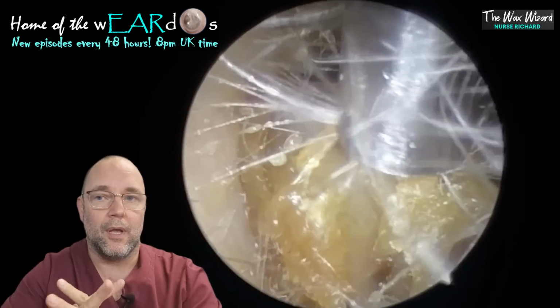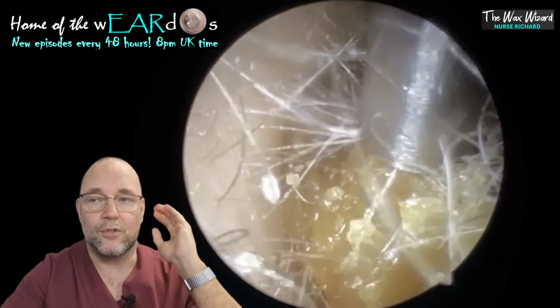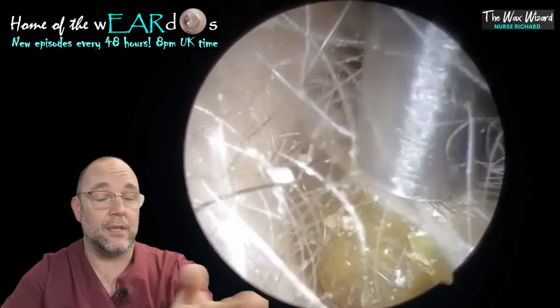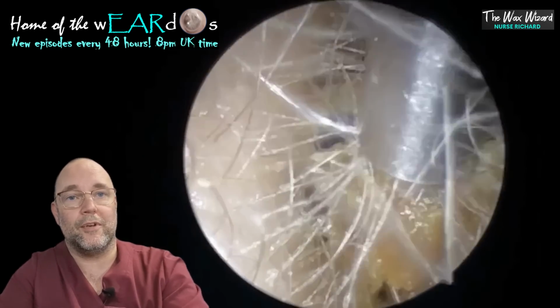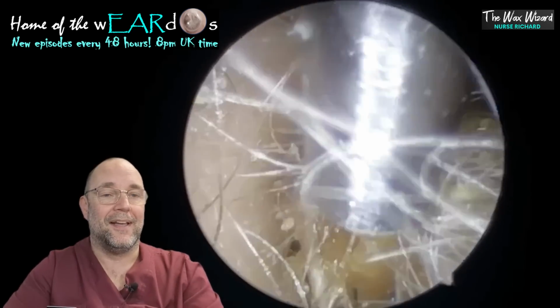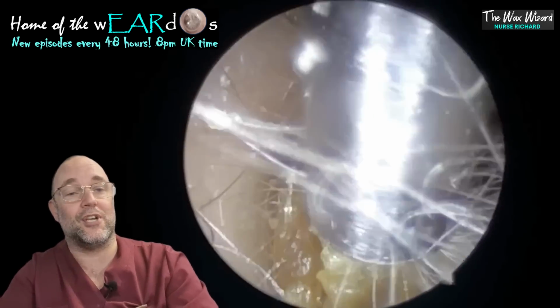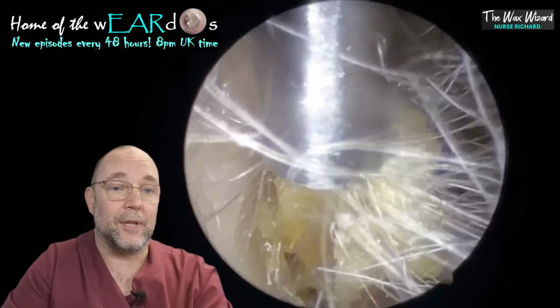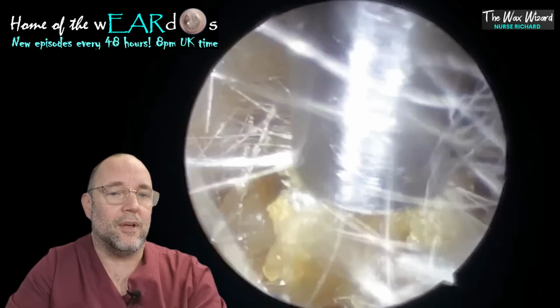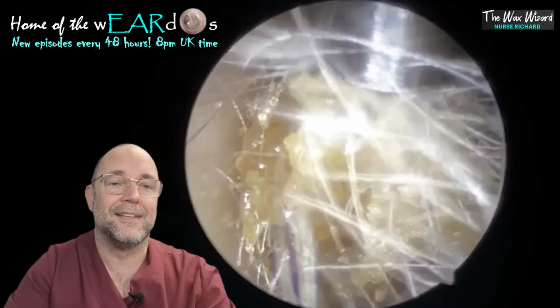And the reason was, he kept moving away from me. Now a lot of people do this when you're already in someone's ear and they can hear a noise. Because there is a bit of noise in this procedure, as you can hear, because we leave the sounds on. He was slowly moving away from me like this. I'm chasing him across the chair. So I just had to stop and say, listen, I can't reach you anymore. You've moved all the way, and he was leaning on the other side of the chair. I didn't even know he was doing it. A lot don't. It's a completely subconscious thing that a lot of people do.